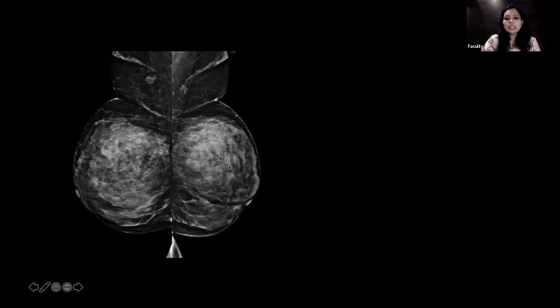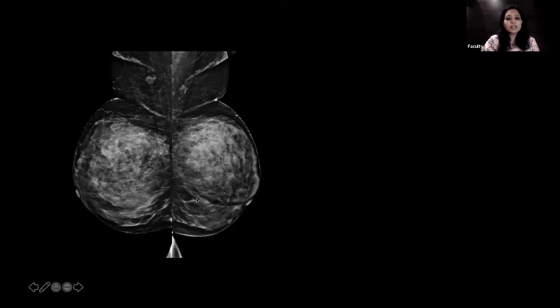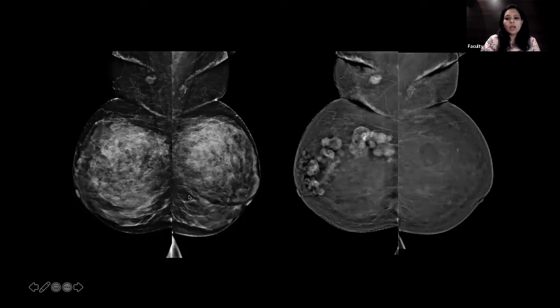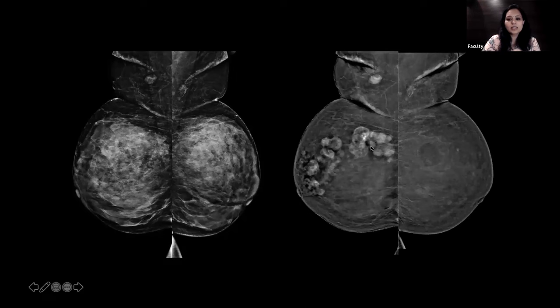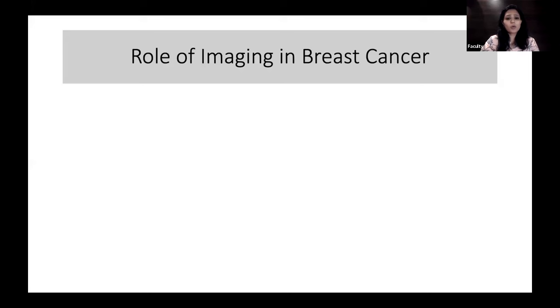In an extremely dense mammogram without clinical history, it is very difficult to identify which side has pathology. Contrast makes it much simpler: the parenchyma is completely suppressed and you can see an extensive multifocal multicentric malignancy with enhancing abnormalities, and also a non-enhancing cyst on the opposite breast. This illustrates in simple terms what contrast enhanced mammography does.